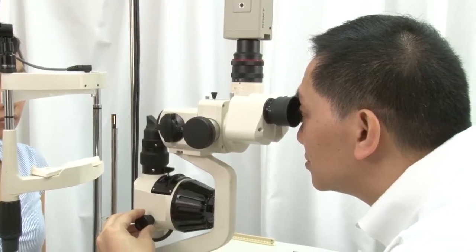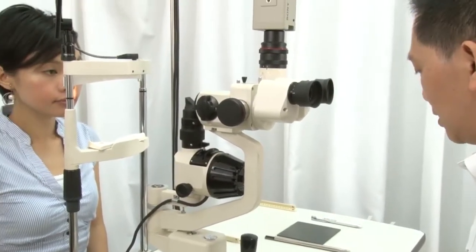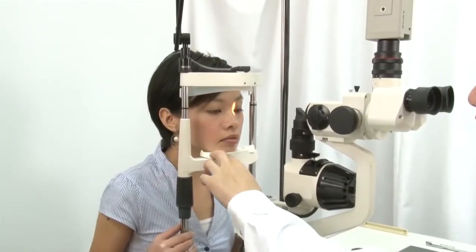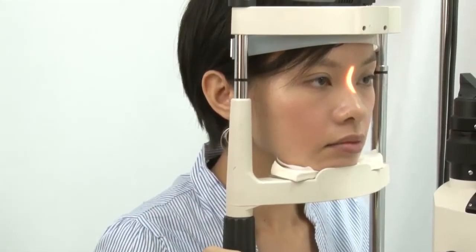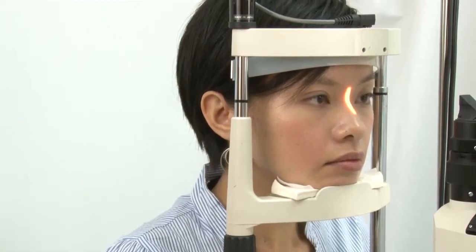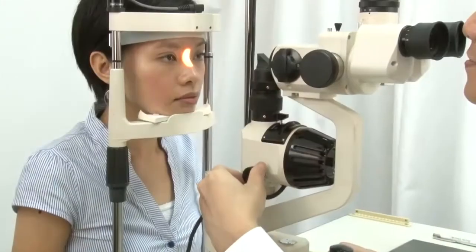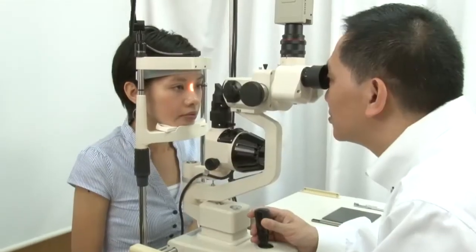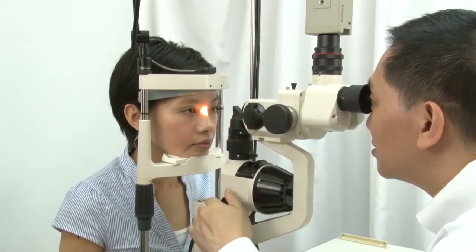In preparation for patient examination, make sure they are seated comfortably. After seating the patient, adjust the table to a comfortable working height. Position the patient against the chin and forehead rests, and adjust the instrument so the index mark on the chin rest assembly aligns with the outer canthus. Before starting the examination, set the rheostat to its lowest level before turning on the power.